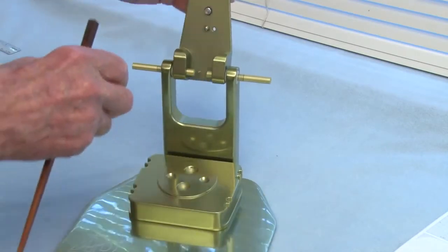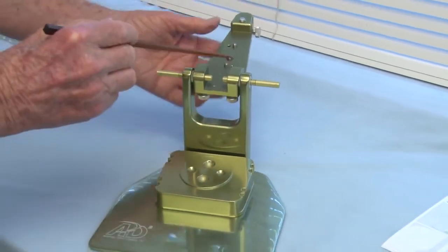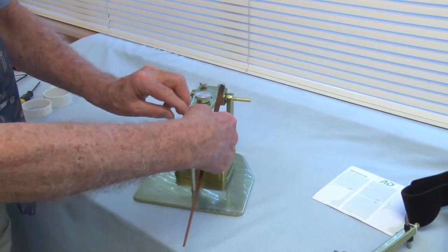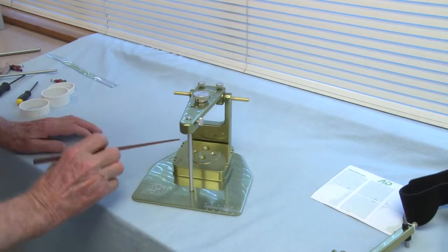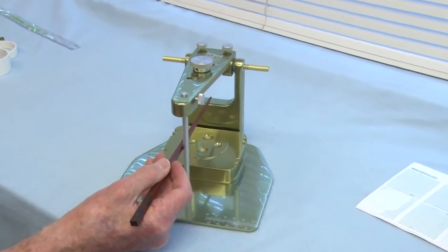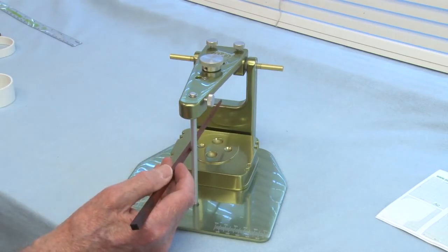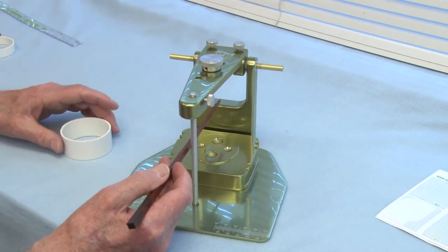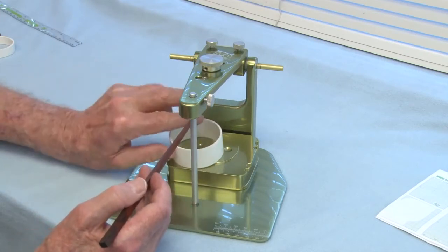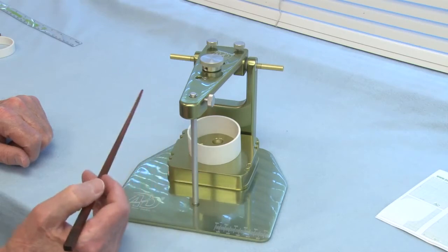The top of the mounting stand works kind of like the articulator. You would put your mounting plate on here, and then when you get ready to mount, you have your bite fork assembly here, and you need to support the bite fork so that when you put your model on, the weight of the model doesn't displace the bite fork. And so these plastic rings are used to do that, and it depends on the length of the maxilla as to which ring you need, but it would fit right over here, and you would fill this with plaster to support the bite fork.